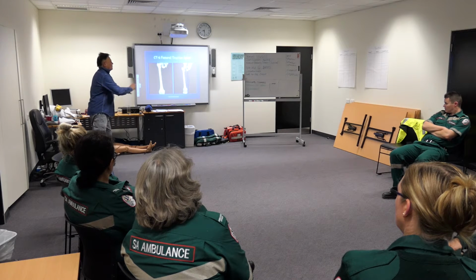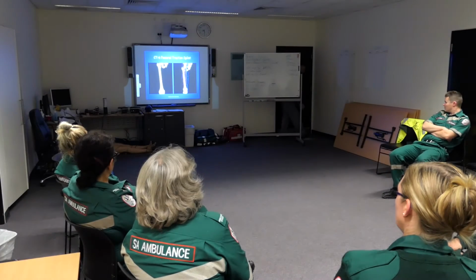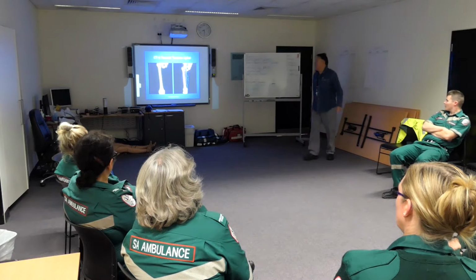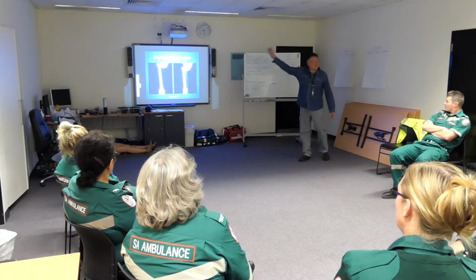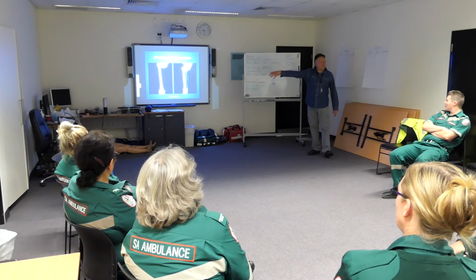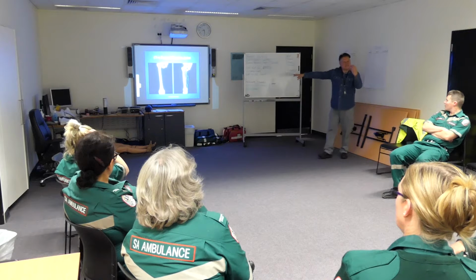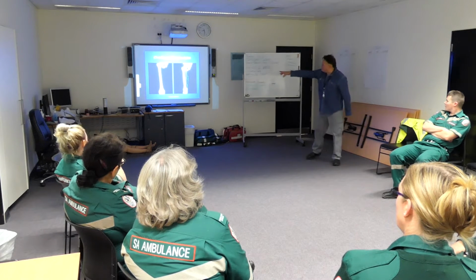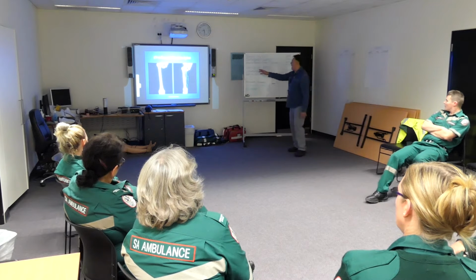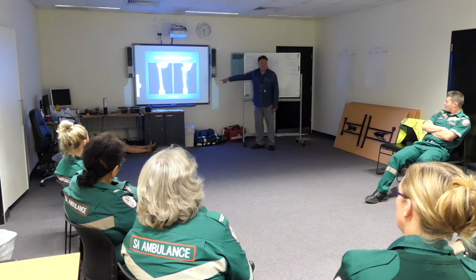Okay, so, let me do this because it's probably better imaging. Can you see this better? Okay, so on the left, I've given you a fractured femur mid-shaft. That's basically the neighborhood we're going to be working in when we're using the CT6. On the right, like I said, I like to see things. I'm a visual learner. I like to see what's happening underneath. So you see the fracture on your right-hand side, but I can also see lots of arteries and veins.